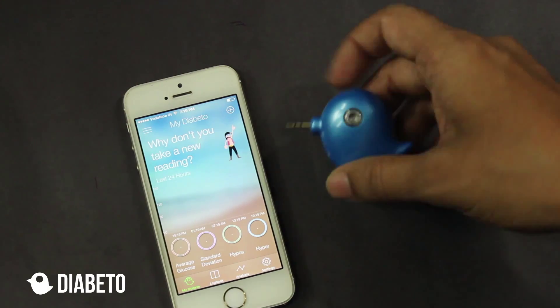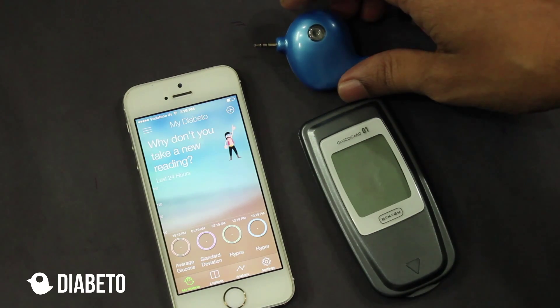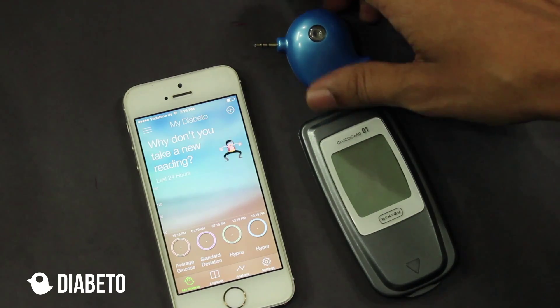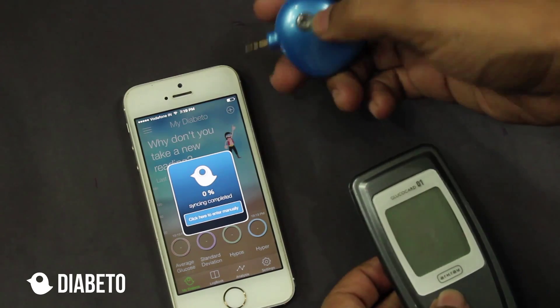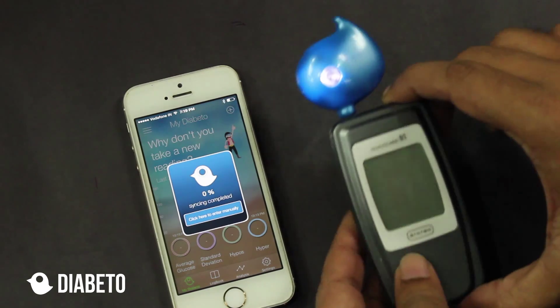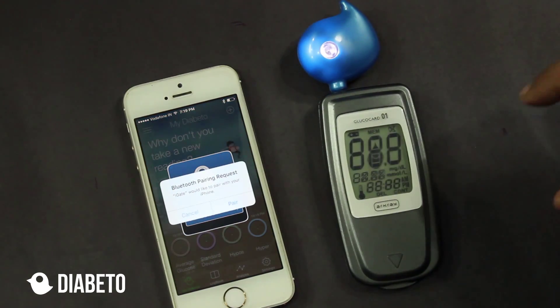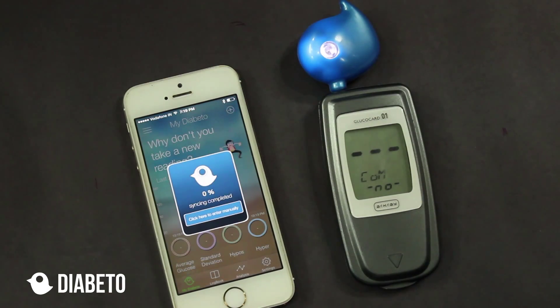What I'll do is take the Glucocard and the Diabeto, and I'll press the sync button and switch on the Diabeto hardware and plug it in to the glucometer. The first time it gives me a Bluetooth pairing request. I pair it — this is just a one-time process and you don't have to do it every time when you sync.